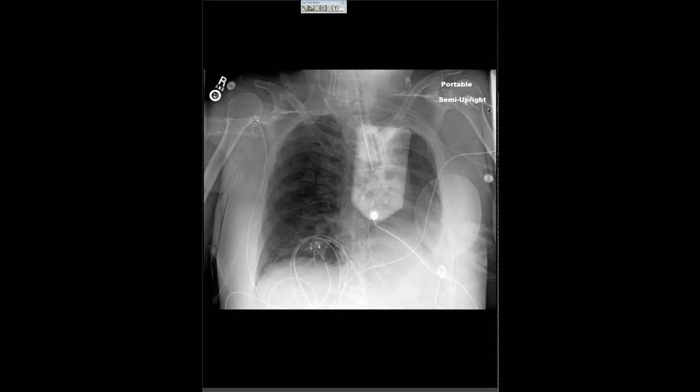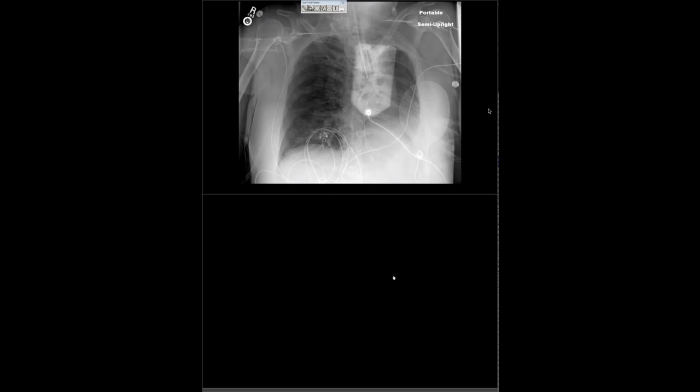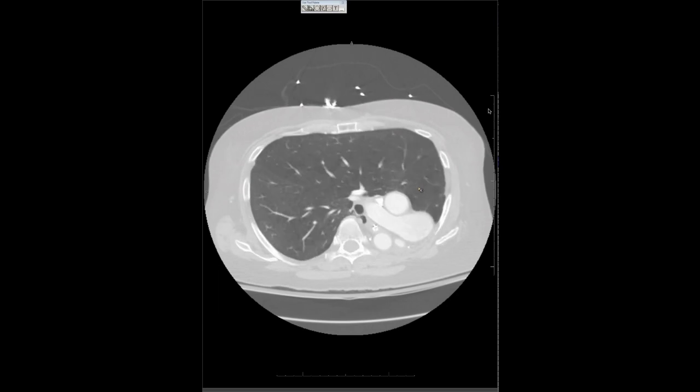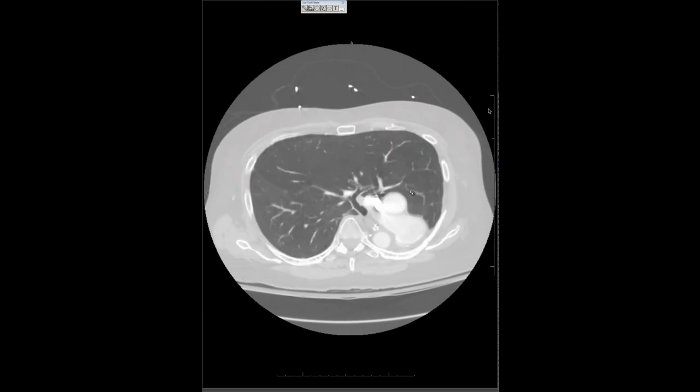And then this other radiograph, also someone in the ICU, also asymmetry of the lungs. So the right lung looks pretty clear, and then the left lung, hard to see. We see some surgical clips. We see probably some leftward mediastinal shift. And this person had had a prior left pneumonectomy. And on CT, this is what their left lung looks like. So their left lung is actually completely gone.